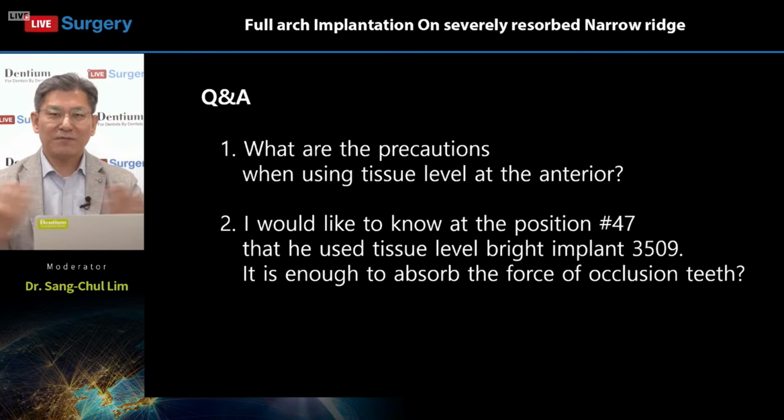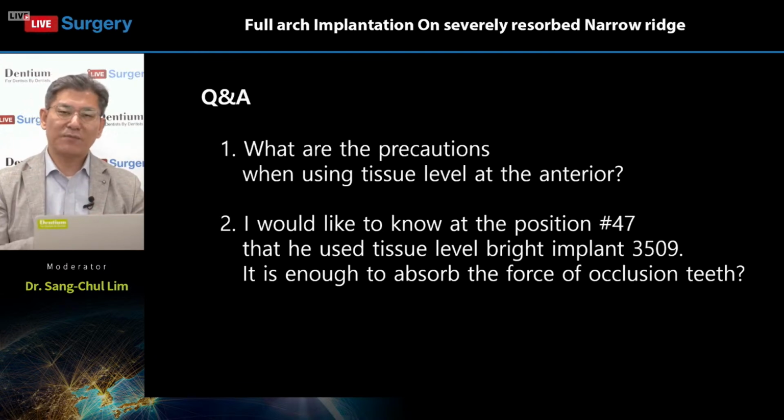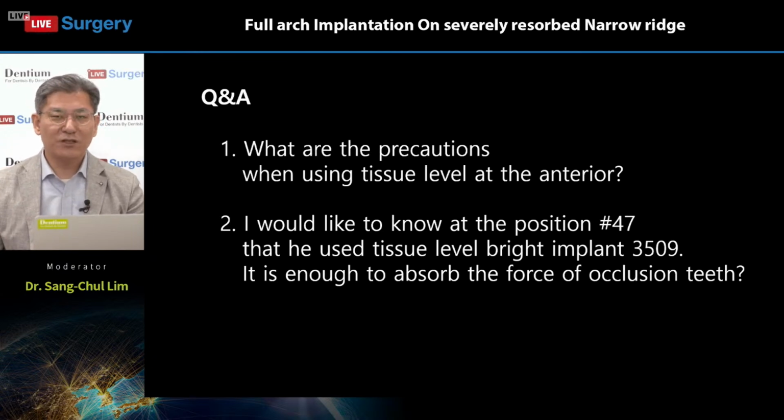Even for a handicapped patient, elder patient, or a compromised patient like this, it can be acceptable with a minimalism concept, as in this picture. So Dr. Chung suggests a minimalism concept for elder patients using this bright tissue level external connection system. So we can try. And actually so far so good.